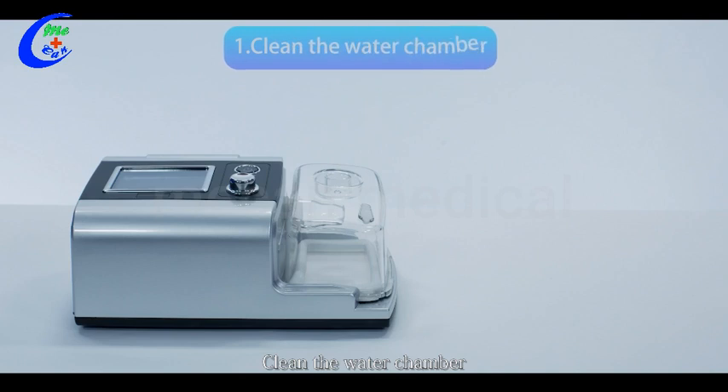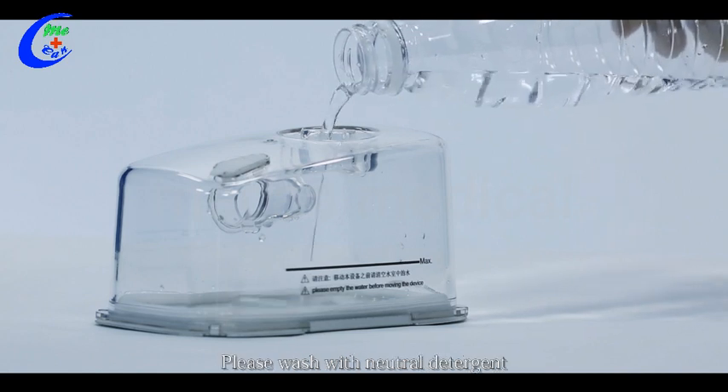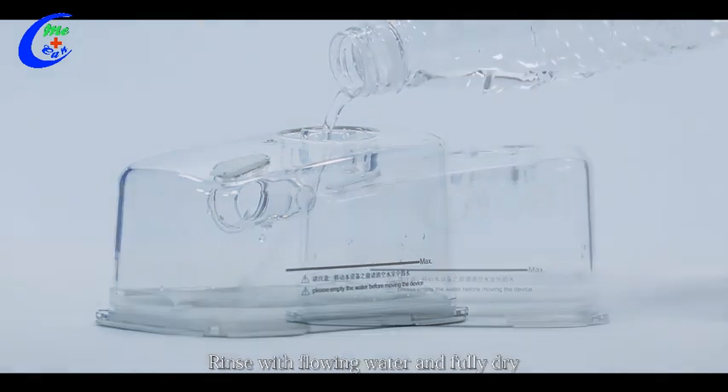Clean the water chamber. Remove the water chamber parallel to the right and wash it separately. Please wash with neutral detergent, rinse with flowing water, and fully dry.